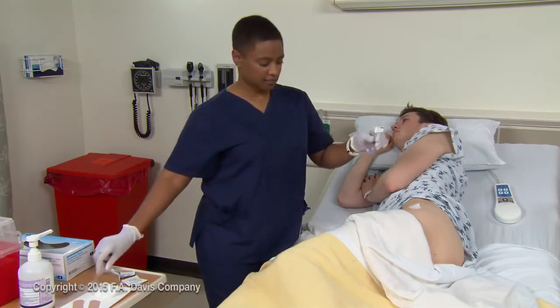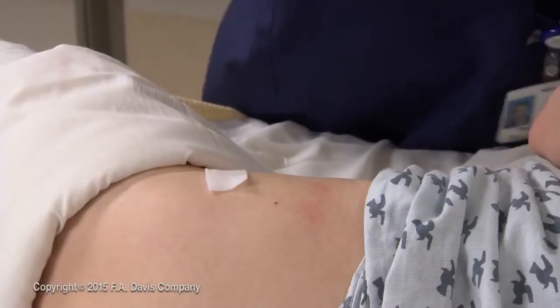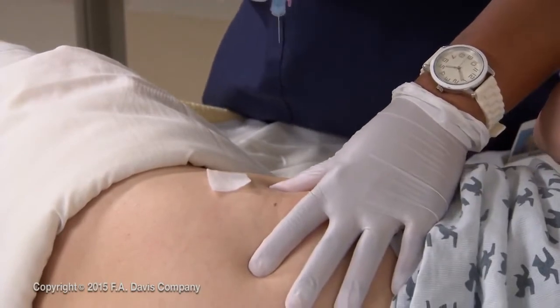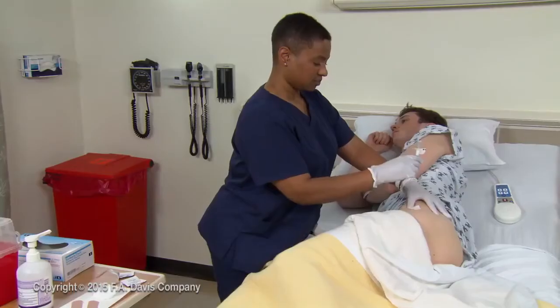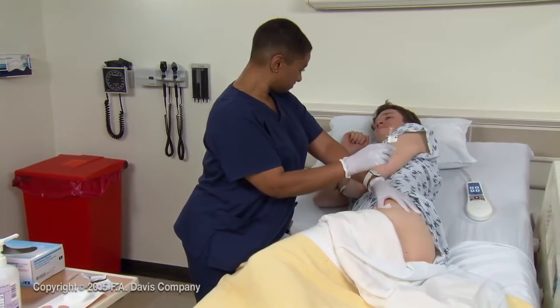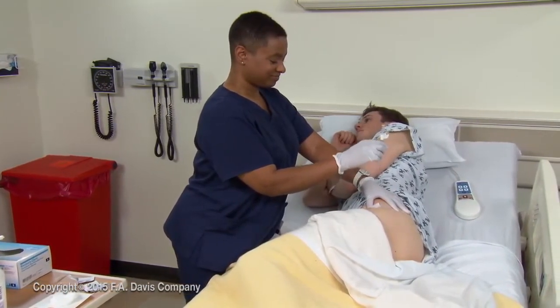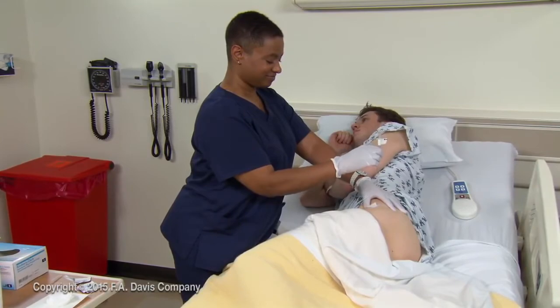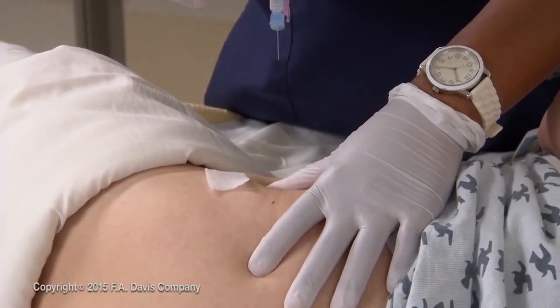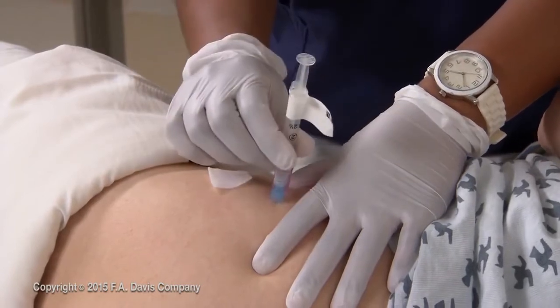Remove the needle cap. With your non-dominant hand, spread the skin taut between your thumb and index finger. Tell the patient what you are going to do, and that he'll feel a prick as you insert the needle. Then hold the syringe between the thumb and fingers of your dominant hand like a pencil or dart, and insert the needle at a 90-degree angle to the skin surface. Insert fully.